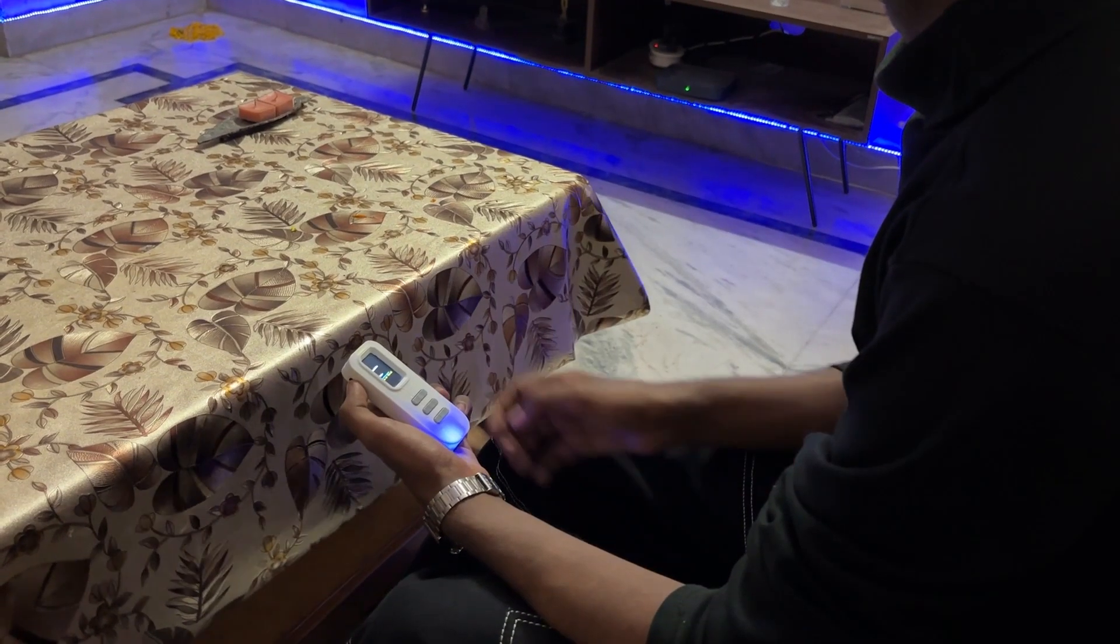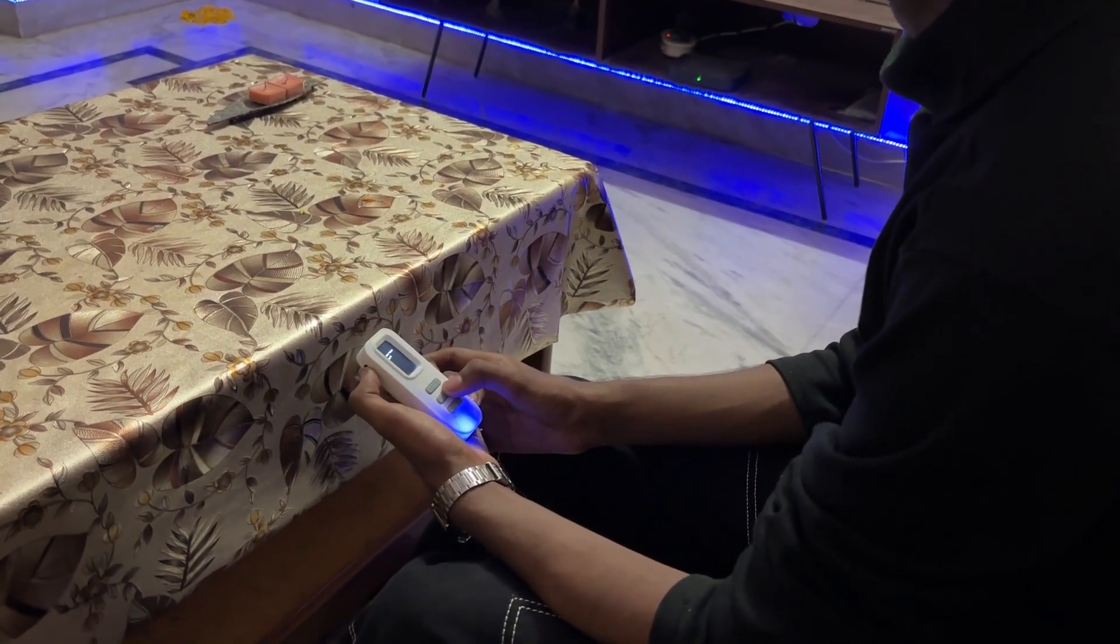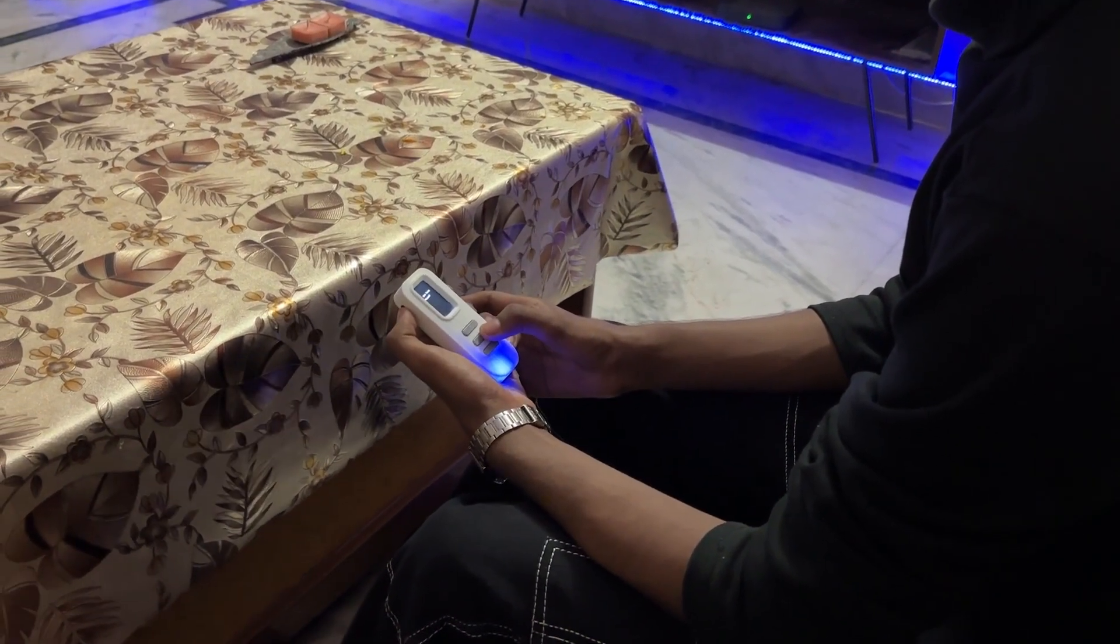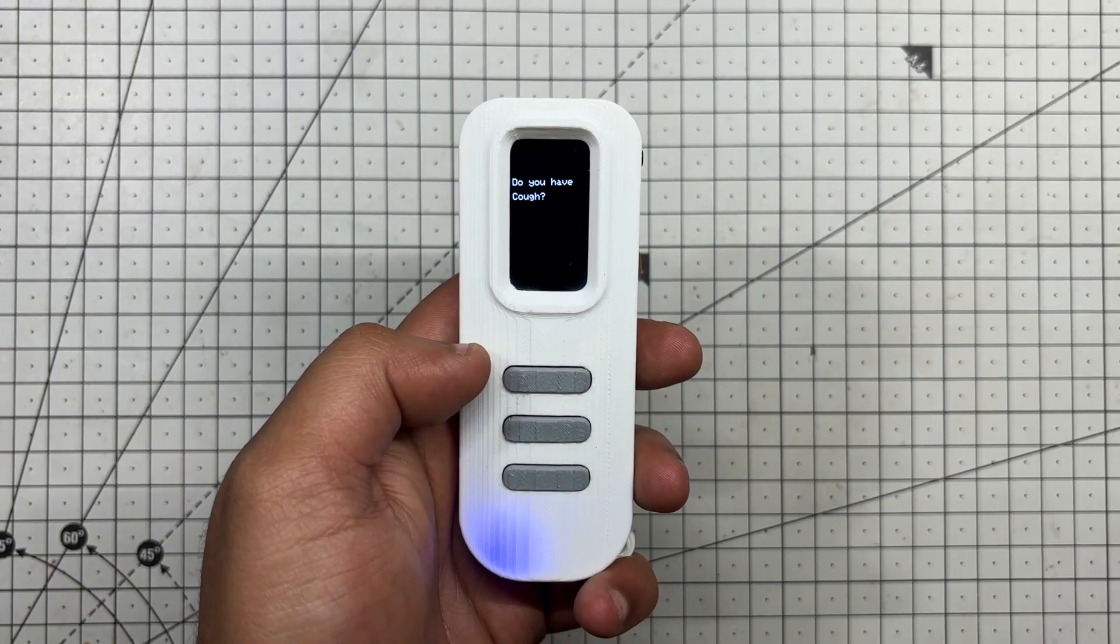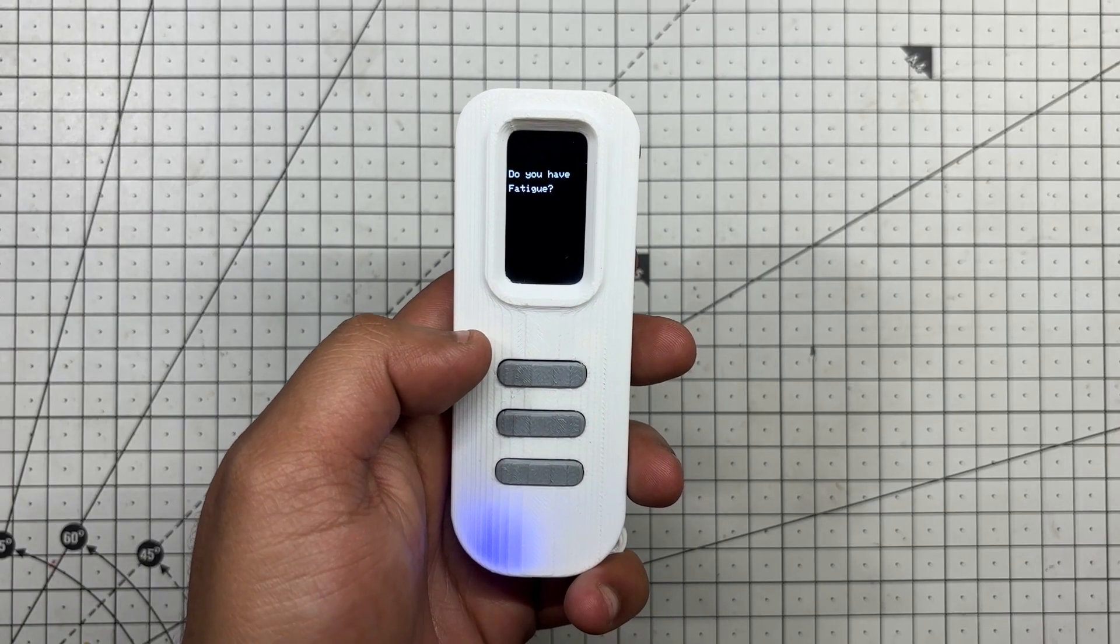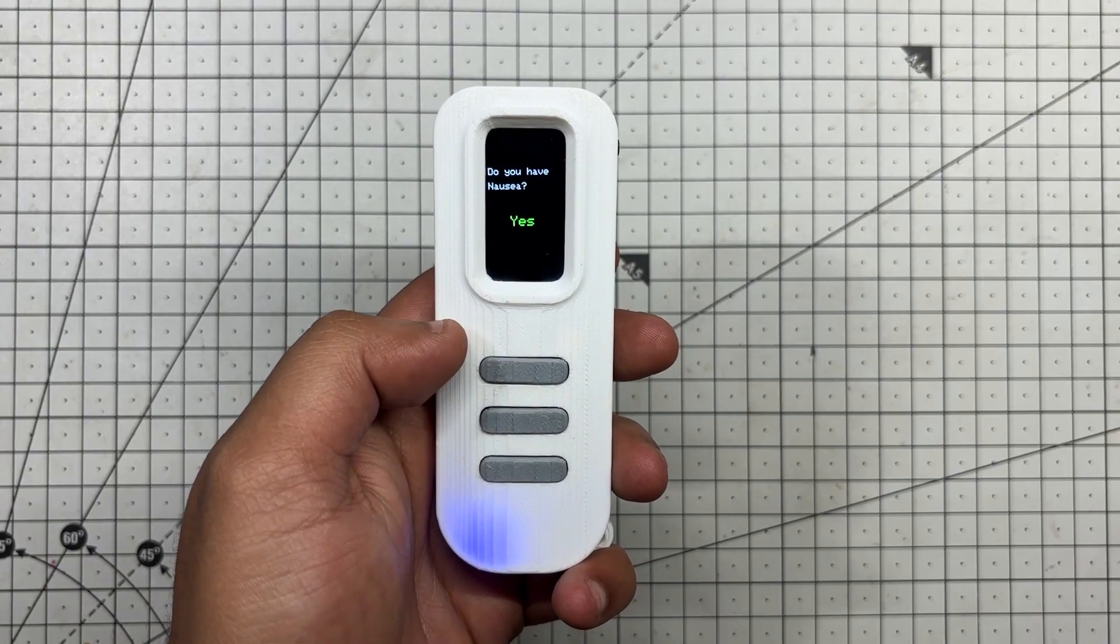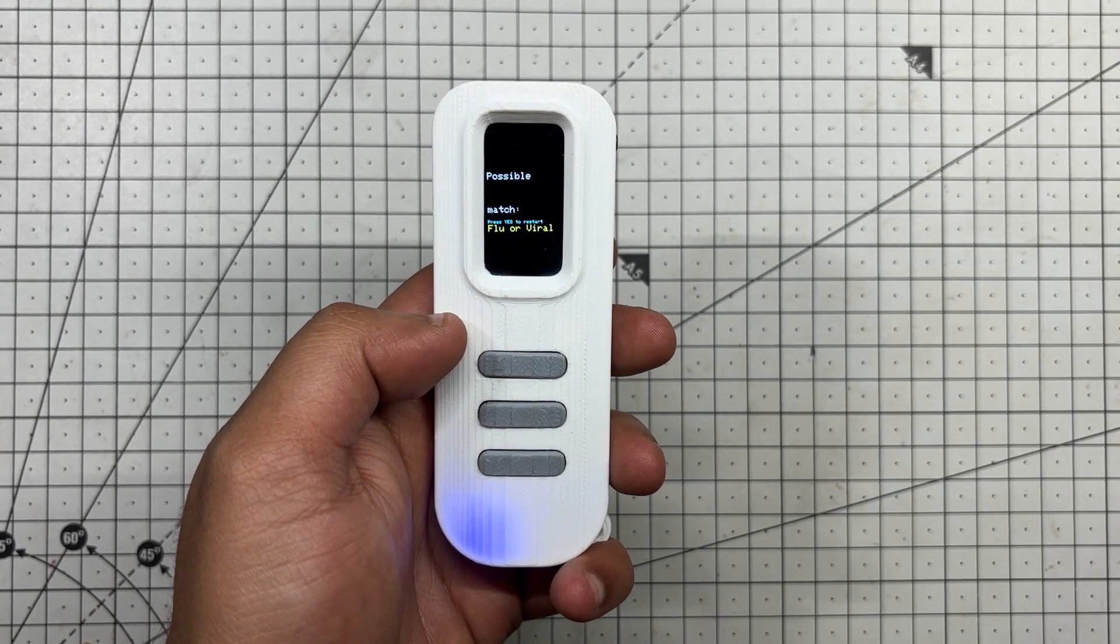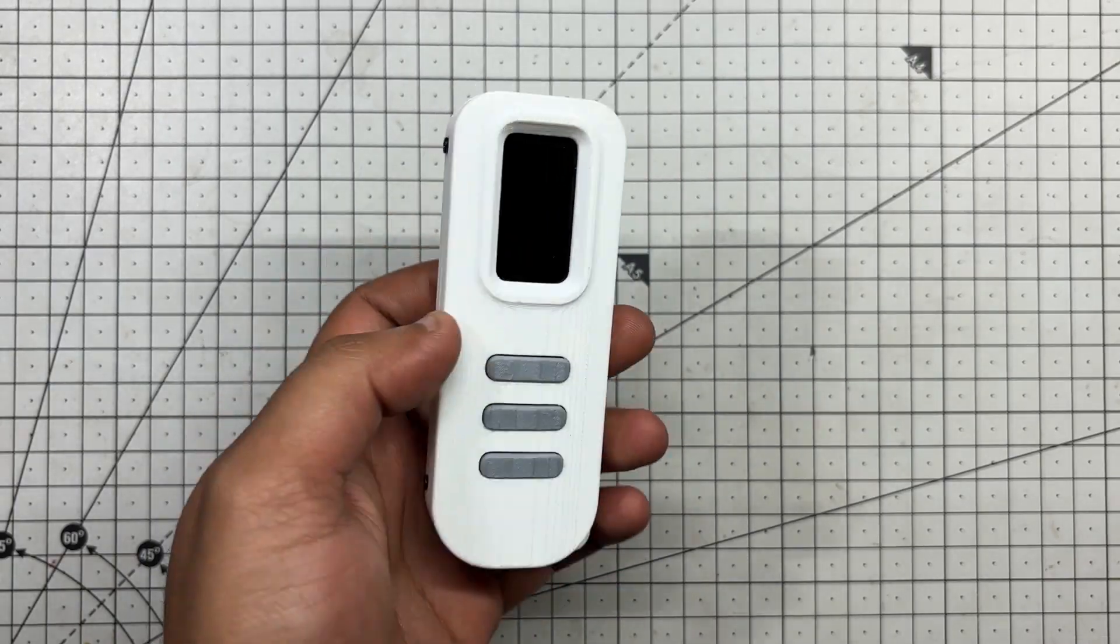After completing the build, I tested Medic Mini by running through the symptom checker, and sure enough, I was greeted with a fever message based on my inputs. The logic worked as intended. The device responds quickly and adequately to button presses. It's a solid proof of concept for a portable interactive diagnostic tool. That said, this is just the beginning.